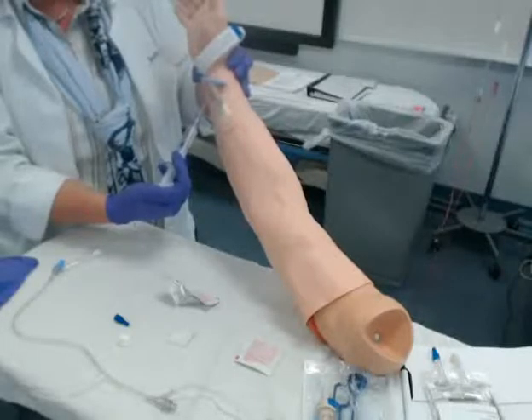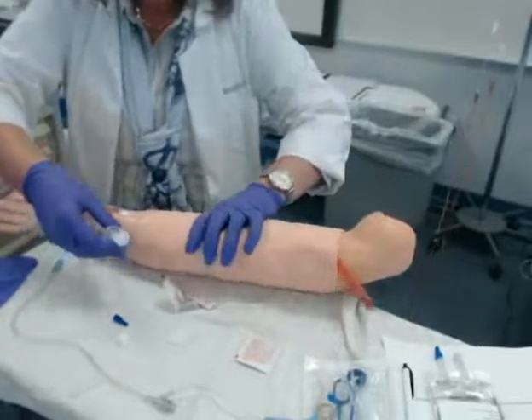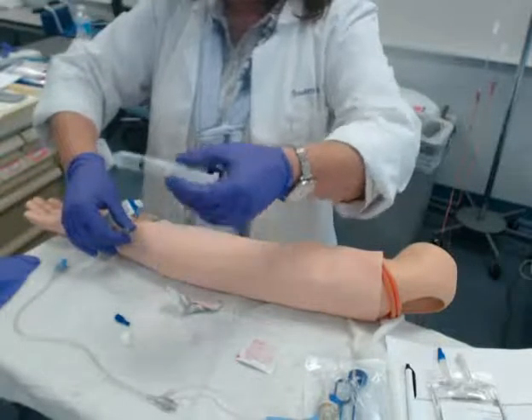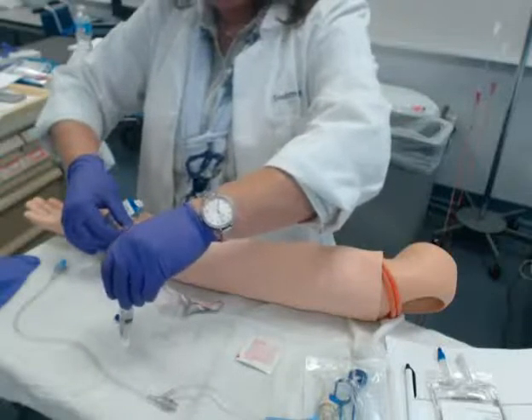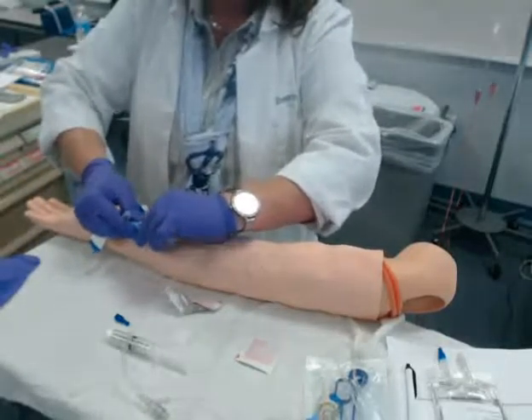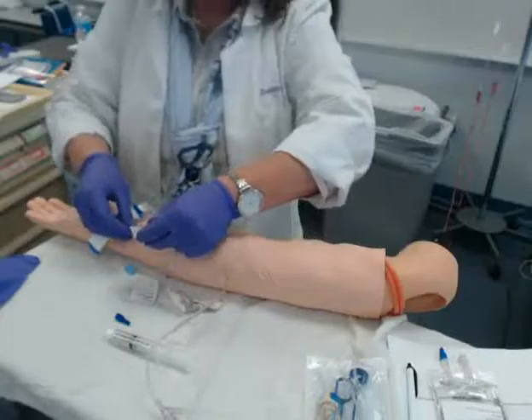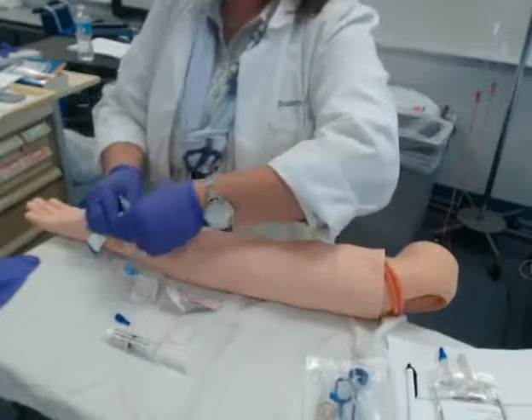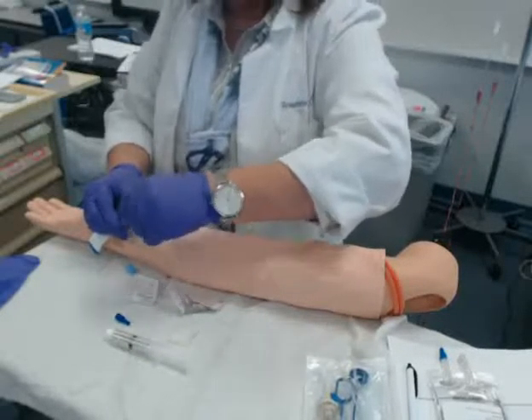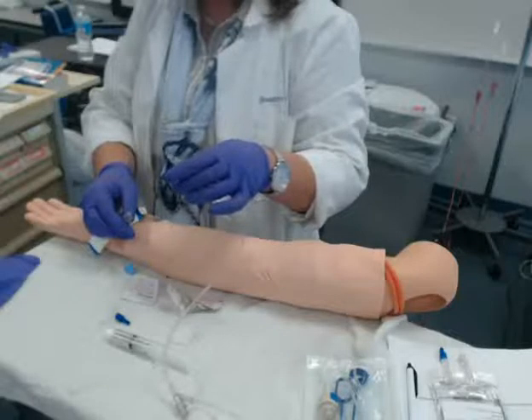When I push my saline in, we use the push-pause technique. Because blood clots and fibrin collect on the end of that catheter, and we want to make sure the push-pause helps flush the fibrin clots away so it doesn't clot. I have aspirated — that's my first sign I'm in the vein. Now I'm going to do push pause, push pause. When I'm doing that, I'm going to assess and make sure my catheter is in the vein — it's not seeping out around it, not seeping through the connections. My barrel is at 10, so I'm going to go down to 5. Push pause, push pause — make sure it doesn't burn my patient. Sometimes saline burns a little bit, but you want to make sure it's not seeping into the skin. Push pause, push pause for 5 mLs.